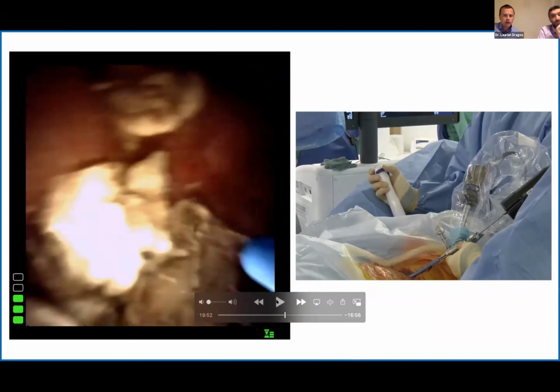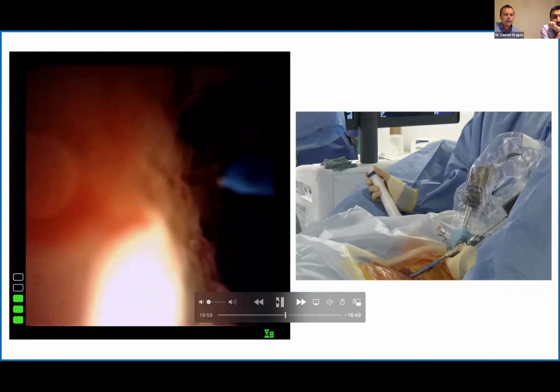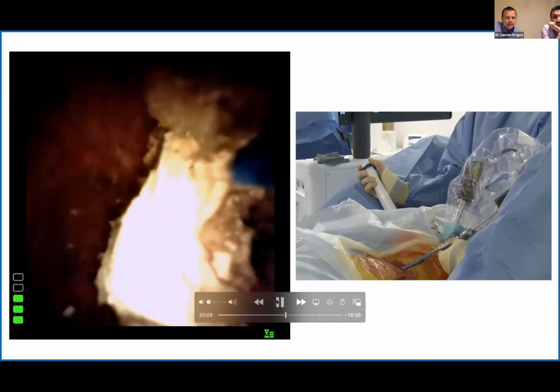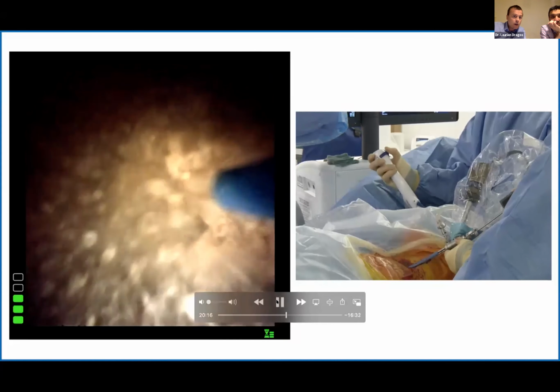Please have a look at the right part of the screen. You see, I'm not holding the scope properly, or as I would usually hold it. I had to move it and work upside down, as you can see on the screen, to reach the stones in a better way. However, there are a few small tricks. If you look at my fingers, maybe it's not the best view. When I'm holding the scope, you can see my hand. I will try to hold it with this part, so the scope is more or less here. It allows an extra movement, and it even allows me to turn it and use the lever with much more ease.